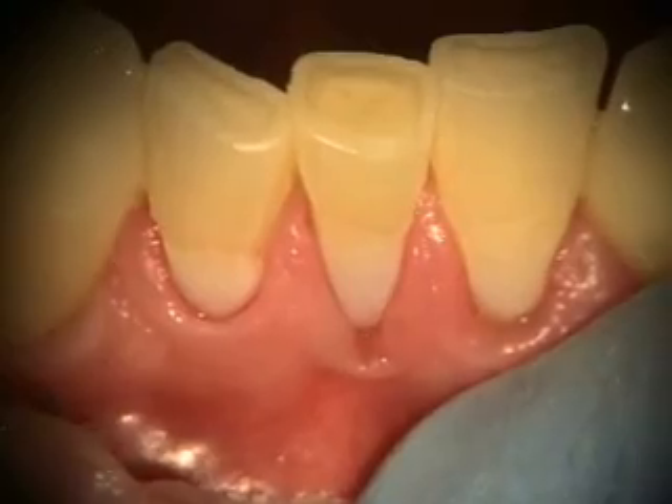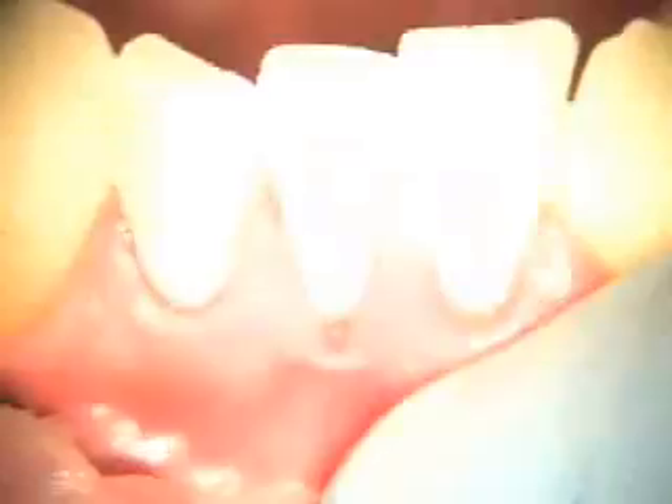There's the finishing of the margin. Take a little closer look.